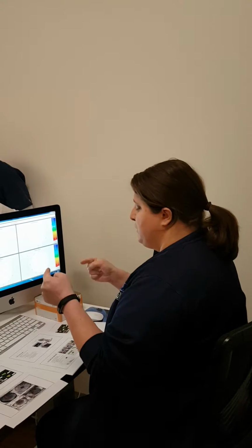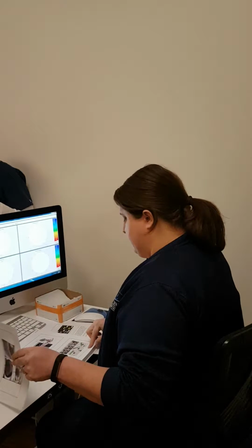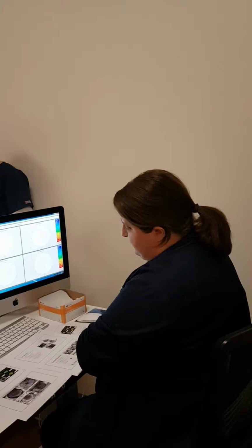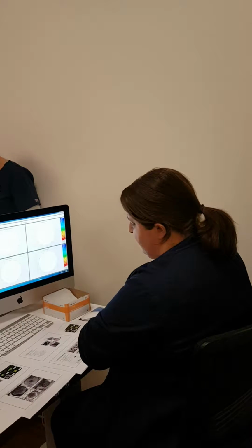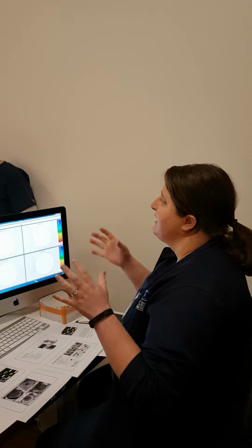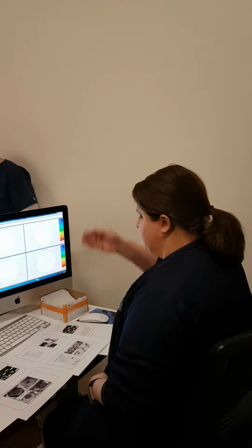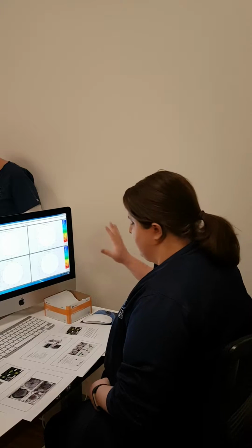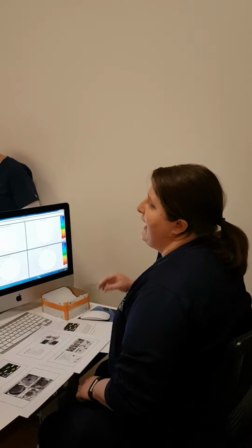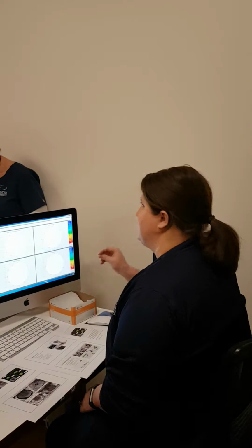Basically, the Pentacam has two cameras, and they're tilted, and on page 6 I go into a little bit more detail about the Scheimpflug imaging, and basically it has to do with getting a clear image all the way around the cornea. And again, it takes a lot of different segments, gives us thousands of different points for us to be able to analyze the cornea's thickness and shape in as much detail as possible.